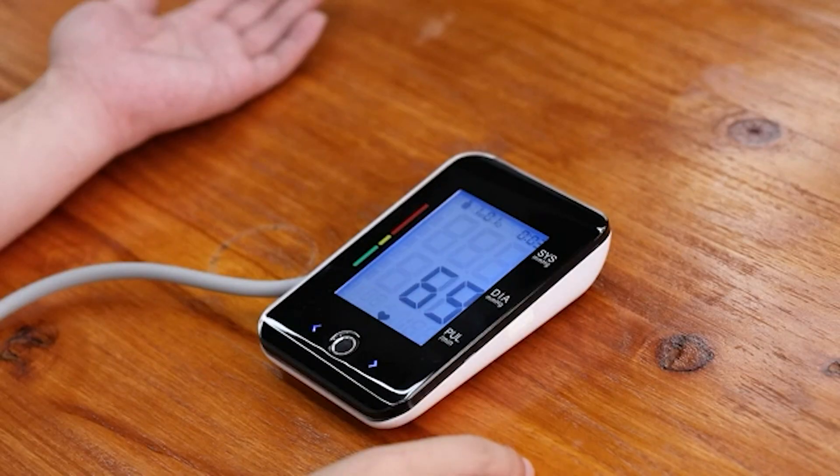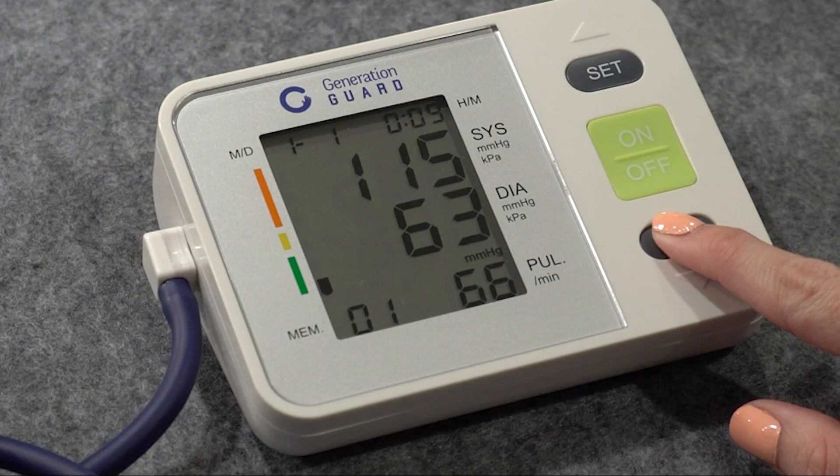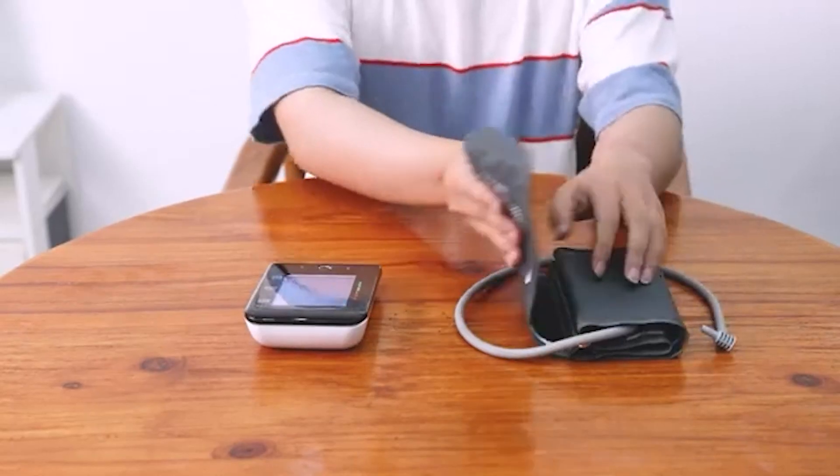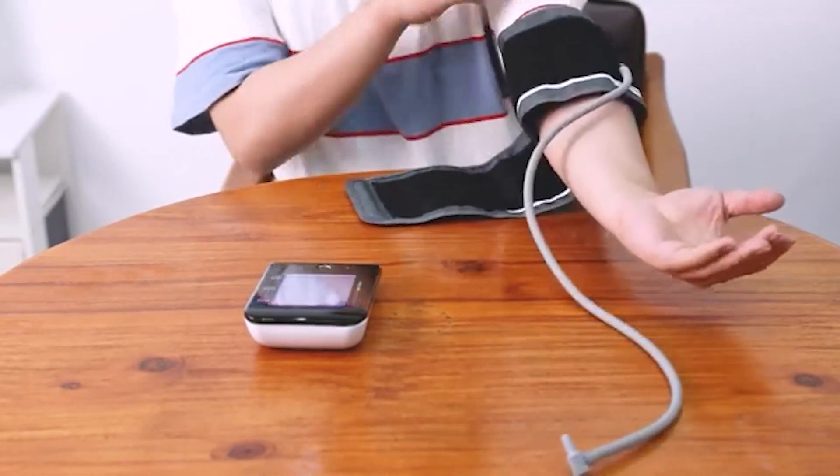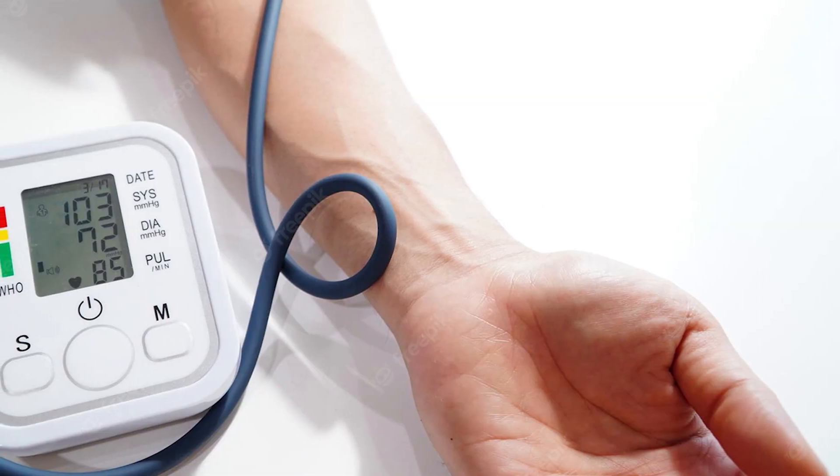Patients should take their blood pressure measurements at the same time of day each time. They should also take a few readings one minute apart and look at the results to get an average. If their blood pressure suddenly spikes during one reading, they should wait 5 minutes and try again. At-home machines aren't as accurate as the ones that doctors and nurses use, so one high reading is not necessarily an indication of an emergency.